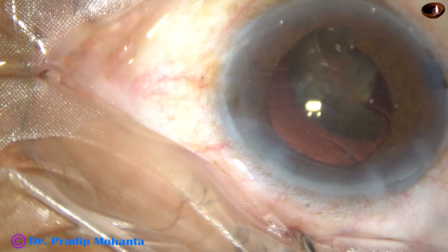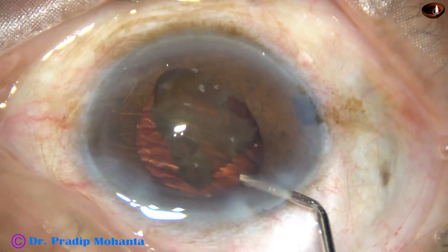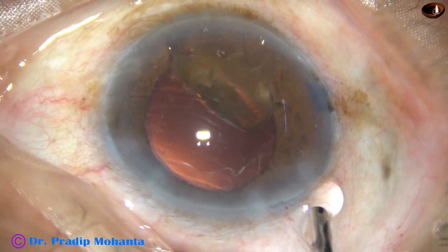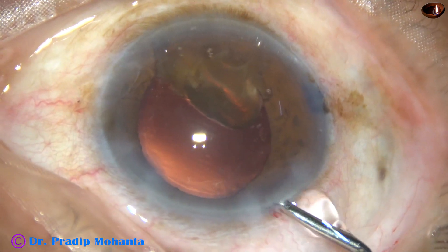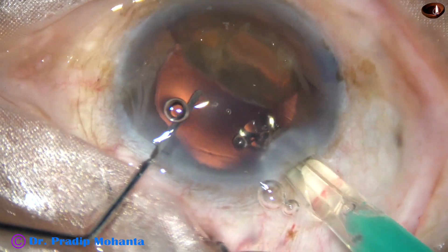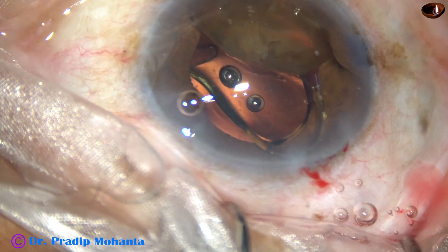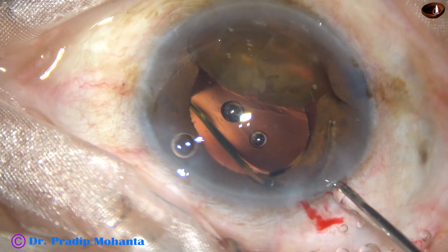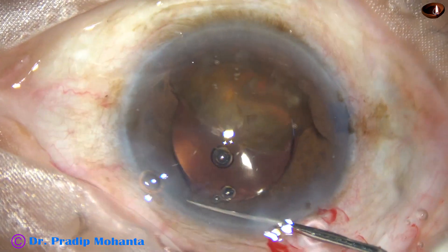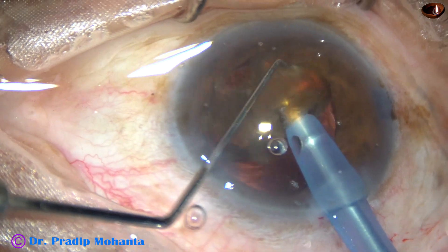I come out, inject visco, and check the main wound — there is no wound burn. Inject visco again, and as I inject visco the small nuclear piece goes towards 6 o'clock. We can see the capsular bag completely. A hydrophobic acrylic single-piece intraocular lens is placed in the capsular bag. Since the intraocular lens is thinner, it goes on the posterior part of the capsular bag, and there is a lot of space to emulsify this portion of the nucleus.